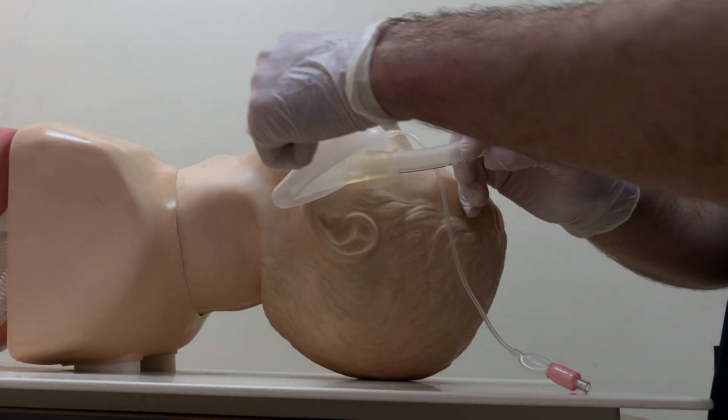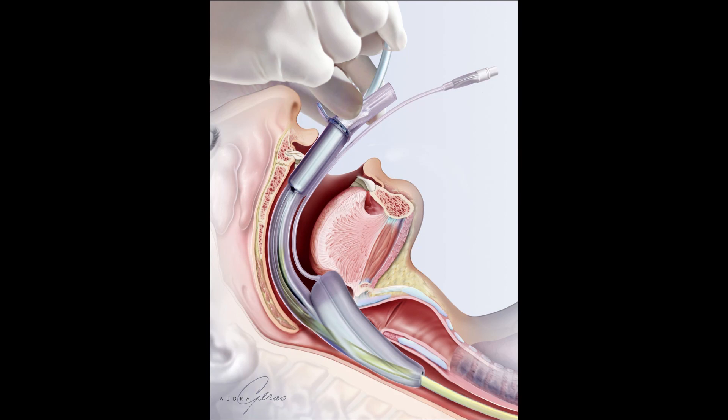The laryngeal mask airway does not create complete airway control, so it does not protect the airway from gastric content aspiration. We have to use the LMA only for patients who have no gag reflex and are not conscious.